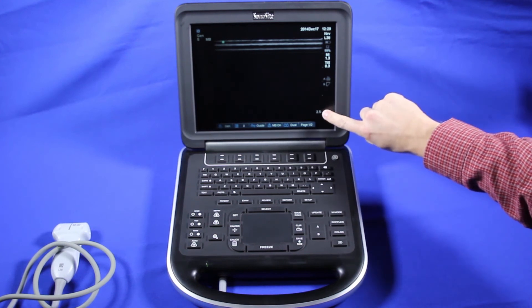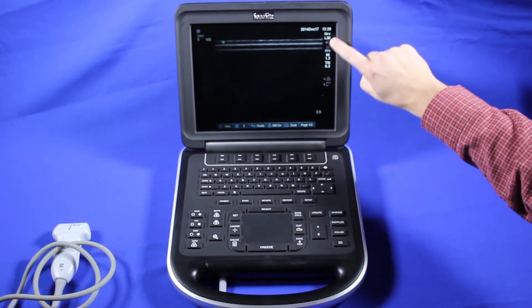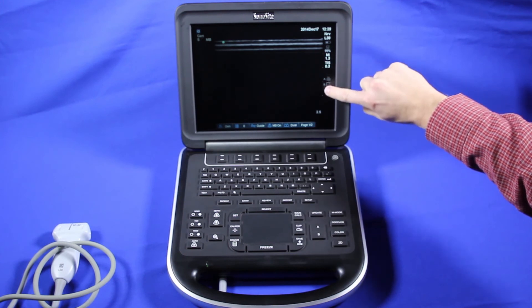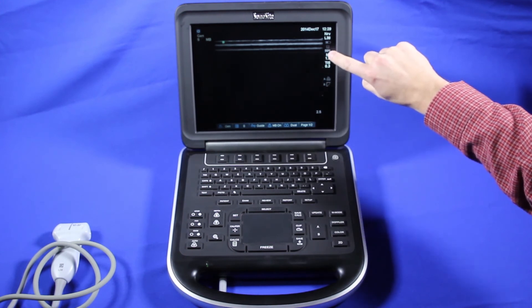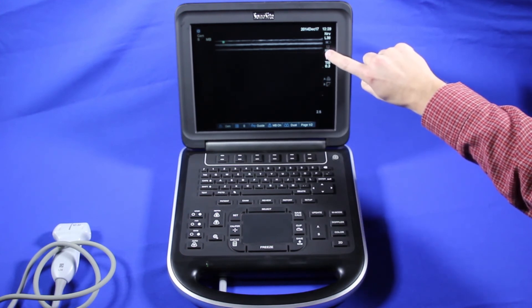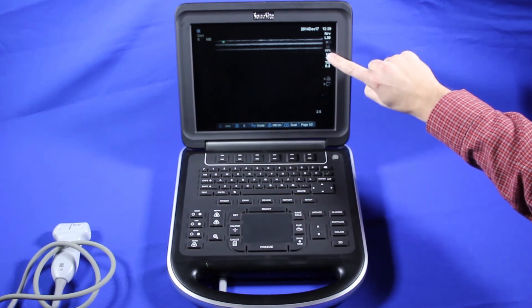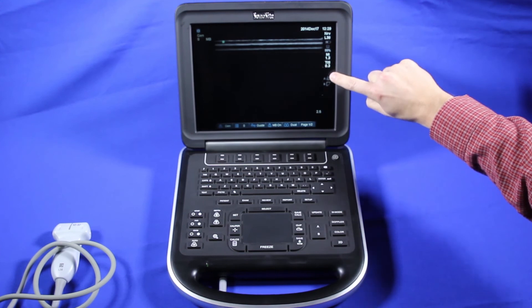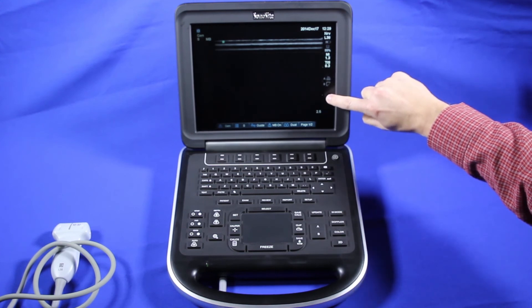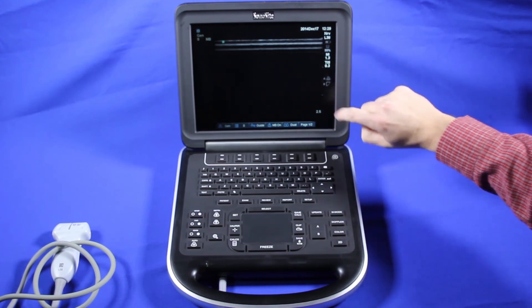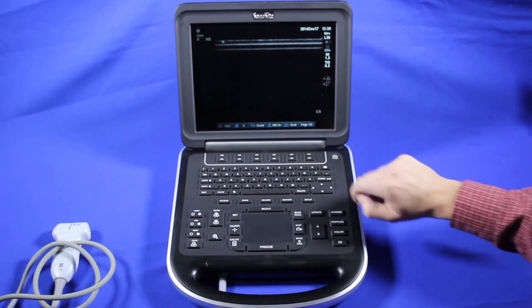Here you have your depth marker showing the bottom of the depth. There are little dots here which represent half a centimeter at this particular depth — 0.5, 1, 1.5, 2, and 2.5 at the bottom.